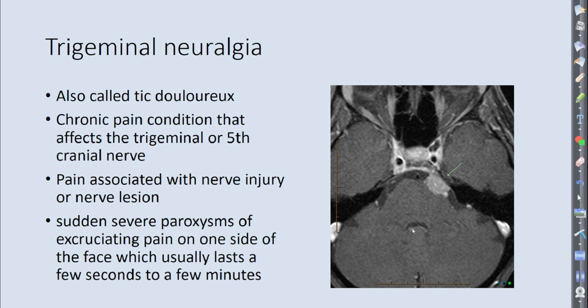It's tough to tell because you don't really have any fluid on this particular slice of the brain. But here's the pituitary gland right here. Pituitary gland is lit up with contrast. And remember, pituitary gland always highlights contrast. So we know this is post-contrast, and typically we always run T1's post-contrast. So T1 post-contrast, and it's fat-satted because the retroorbital fat right here is nulled out.